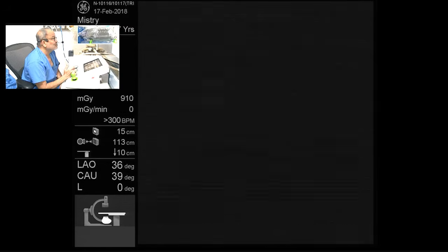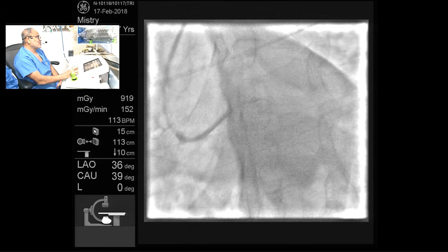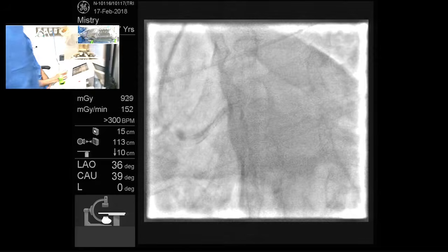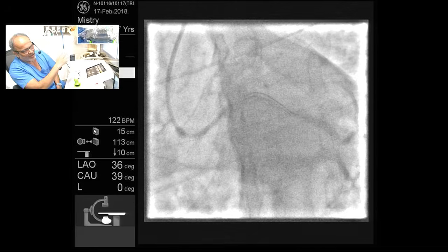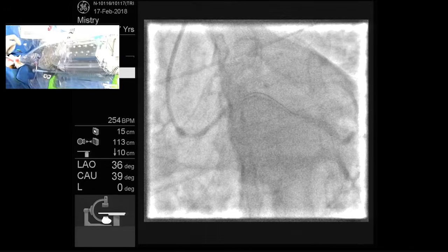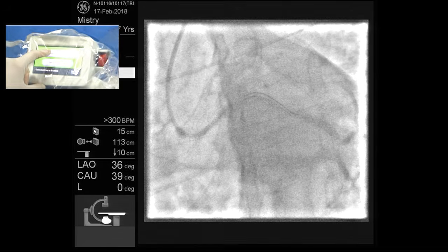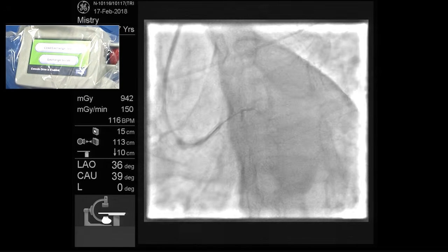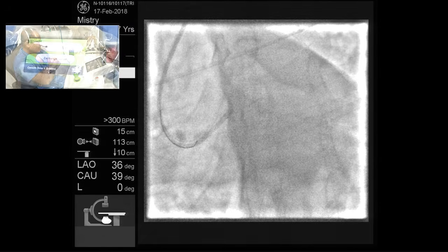No. I don't think I will struggle anymore. We'll change the shape. And you guys might be feeling, why am I struggling? But this is a new technology. Any new technology has a price to pay. You have to go through this process. I'm removing it.